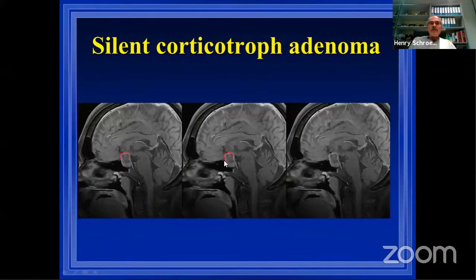But obviously, there was a folding of the diaphragm because the original position of the diaphragm was that way, and then the tumor pushed it up so that we had the duplication of the dura here, and that's why I cut straight through this. This is unusual, but can happen.